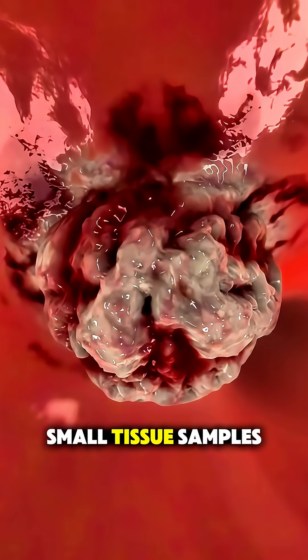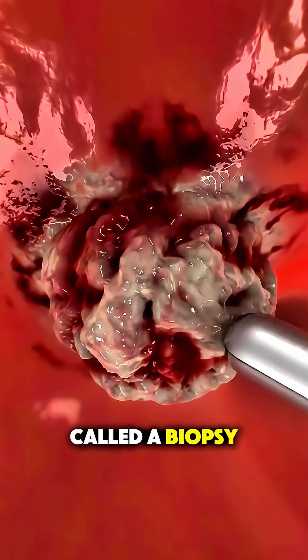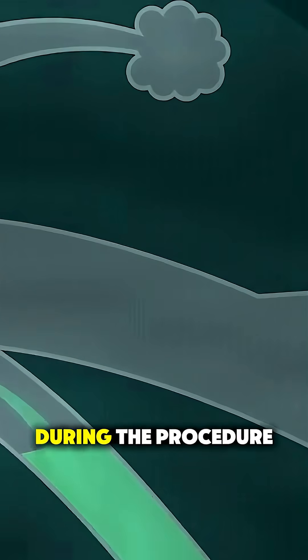Sometimes, they'll collect small tissue samples, called a biopsy, or remove mucus or foreign objects during the procedure.